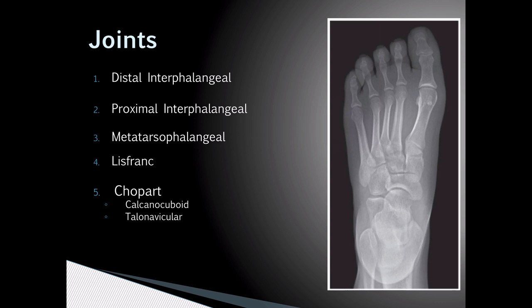Next, we will discuss the joints of the foot, of which there are five. The first being the distal interphalangeal joint, which is only present in the second through fifth toes. Next is the proximal interphalangeal joint. Third is the metatarsal phalangeal joint. Next, we have the Lisfranc joint. And lastly, we have the Chopart joint. The Chopart joint is actually made up of two joints: the calcaneal cuboid and the talonavicular.